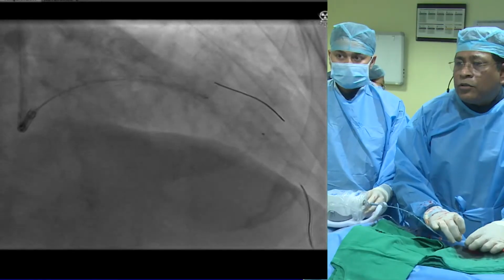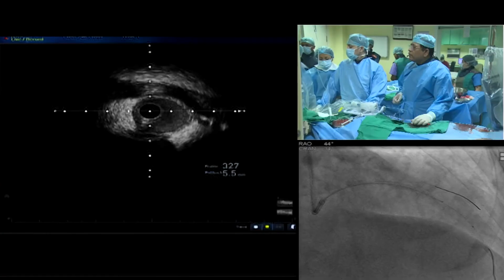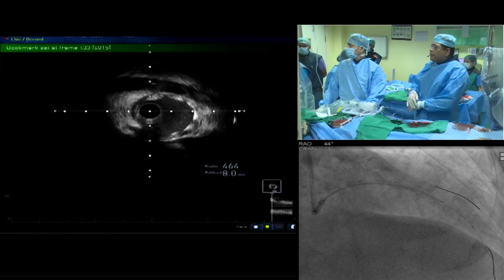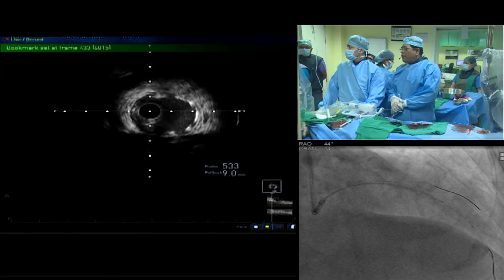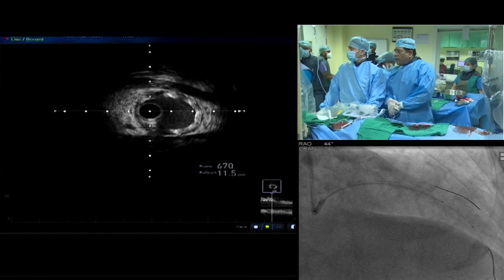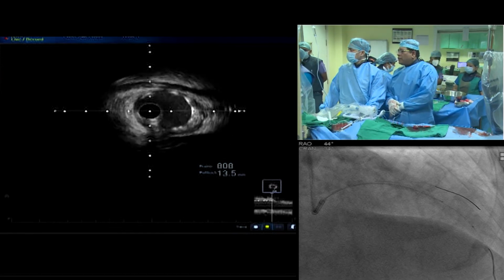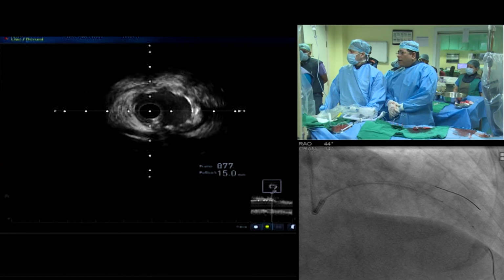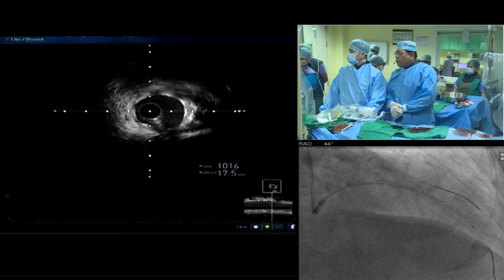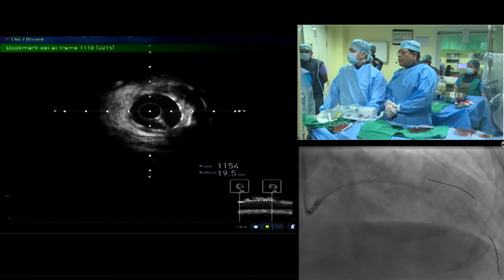Okay. So now we are across the stent. We'll image now. Yeah, a little bit. Yeah, see, landing zone was perfect. Okay, and the stent has landed in the proper place. So it is always good to have some extra length, 1 or 2 mm, and not to be very tight in that situation. And see, it's a good MSA we have got, and it's a fairly expanded stent. No gross underdeployment. Here we can go a little high. Where is this? Okay, just after this bifurcation.